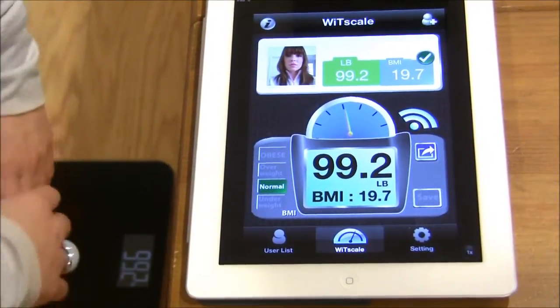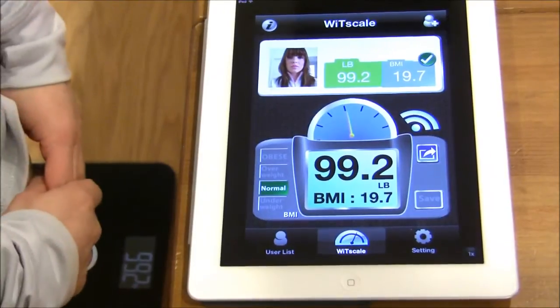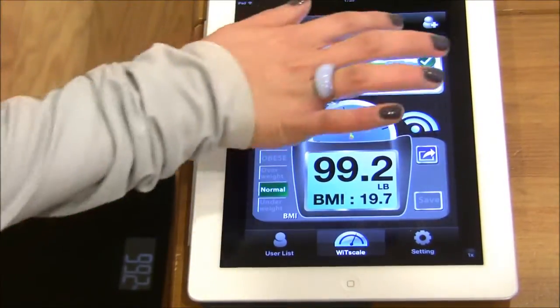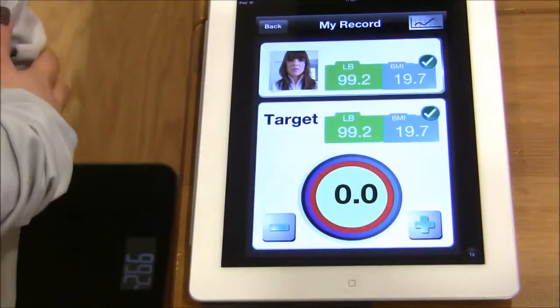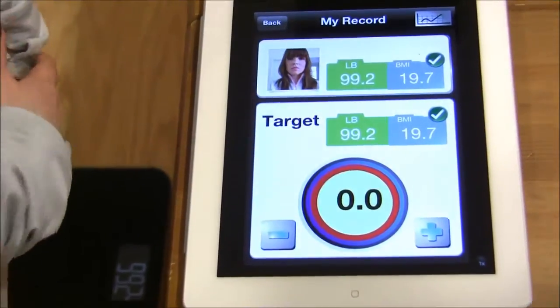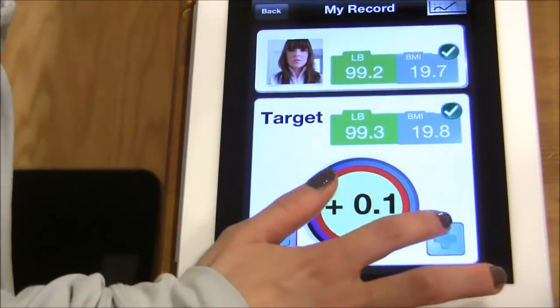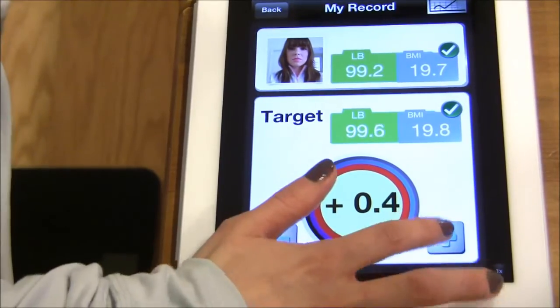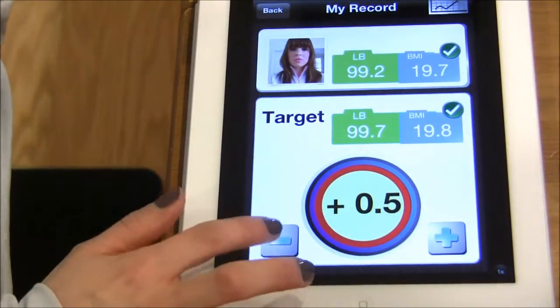If you would like to increase or decrease your weight, you may do so by setting target goals, by either increasing the weight or decreasing.